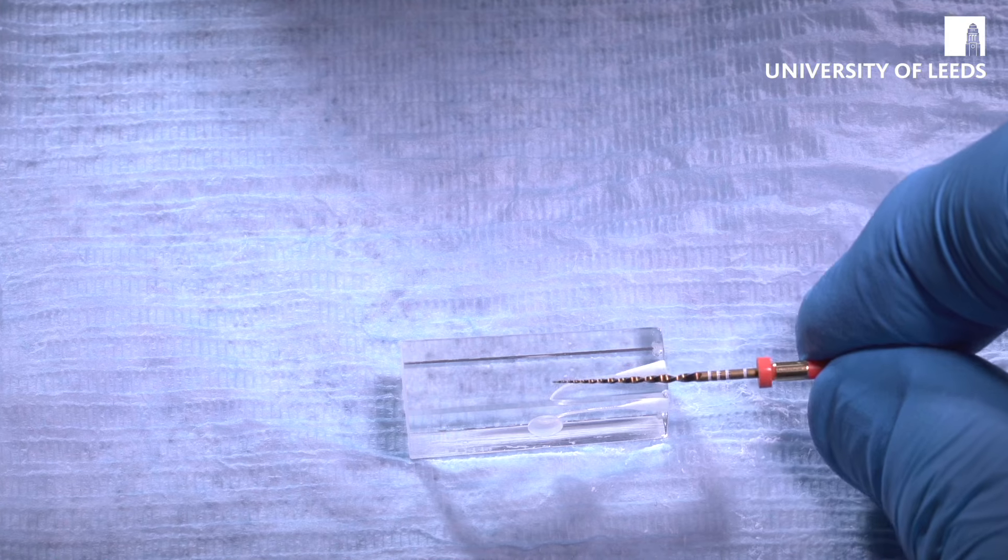Now here I'm going to depart from the standard manufacturer's protocol because WaveOne Gold is described as a single file system. But WaveOne Gold, which is this file here, the primary file, is quite large - the tip is a size 25. So if you've got a tight or sclerosed canal, it's very difficult to get the file to engage straight away. So it is beneficial to use some sort of coronal shaping device or orifice shaper before you go in with the WaveOne file.